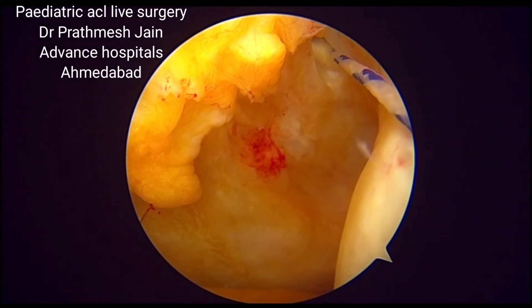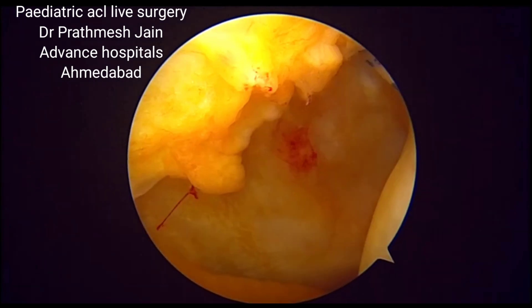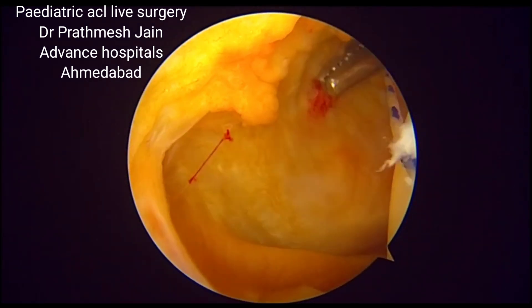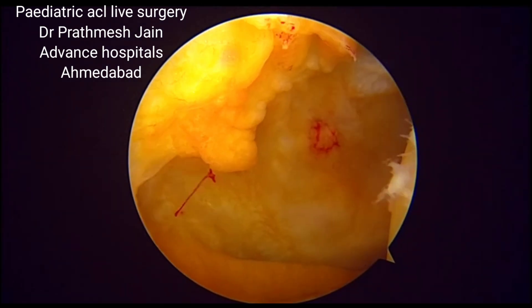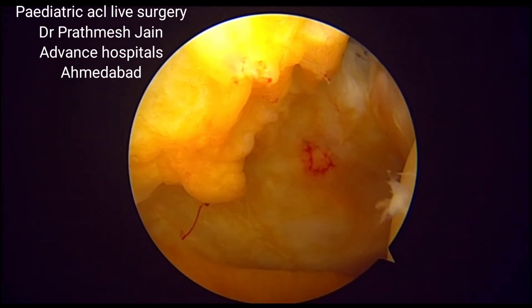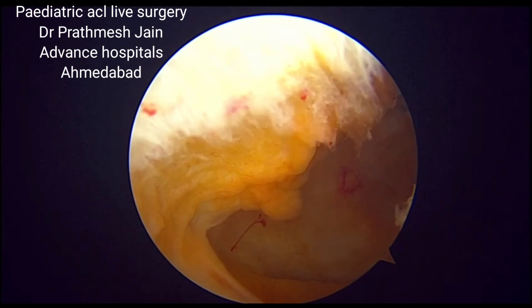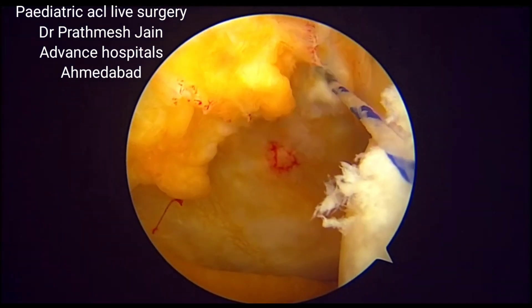The area from which the posterolateral wire is pulled out is dilated so that the graft can be pulled through. We use artery forceps to widen the posterolateral area from which we want to pass the graft inside the knee. We dilate it again so that the fascia lata graft can be passed underneath this structure.